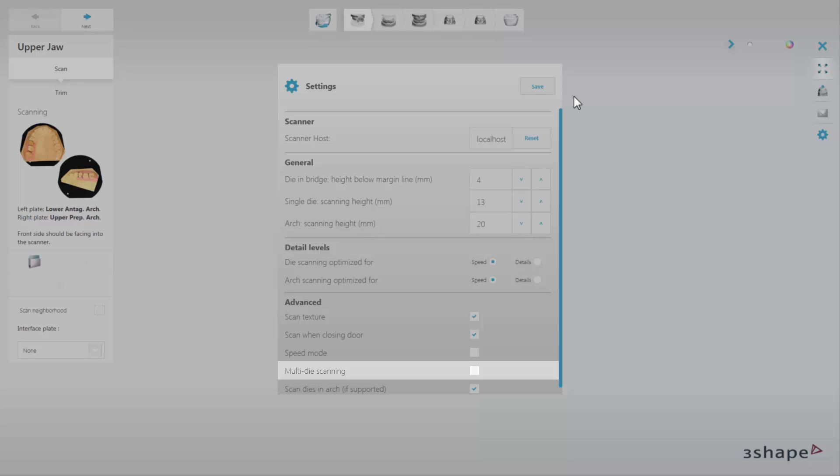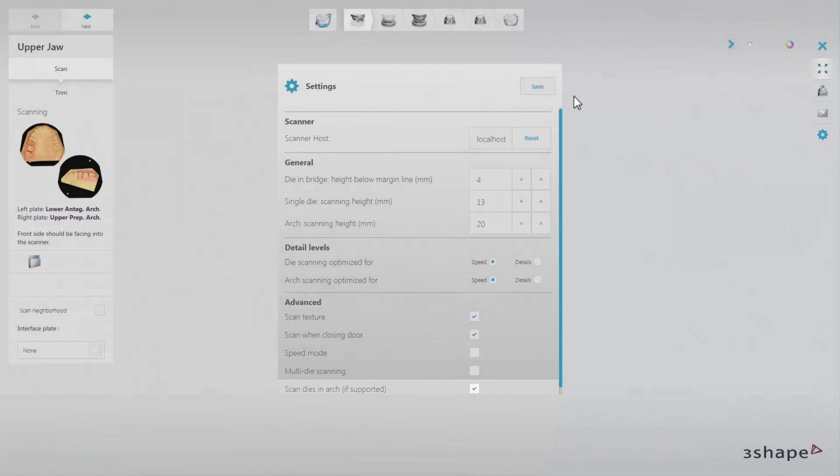Multi-die scanning enables scanning up to 7 dies at the same time. Or the Scan Dies in Arch option, which allows to skip single dies separately. If you mark Multi-die scanning, it will disable the Scan Dies in Arch option, and vice versa.